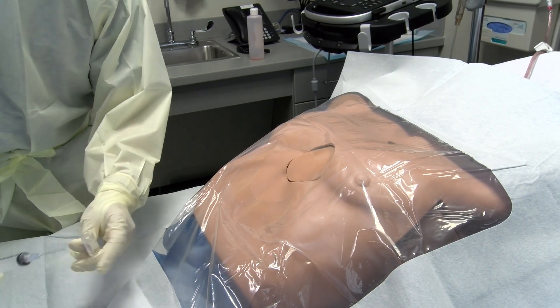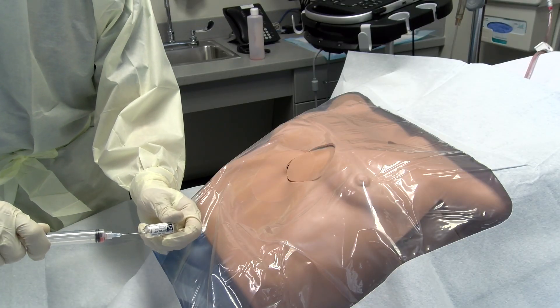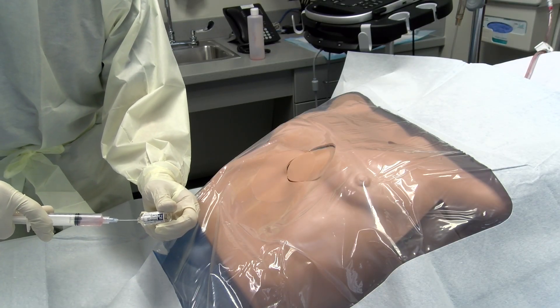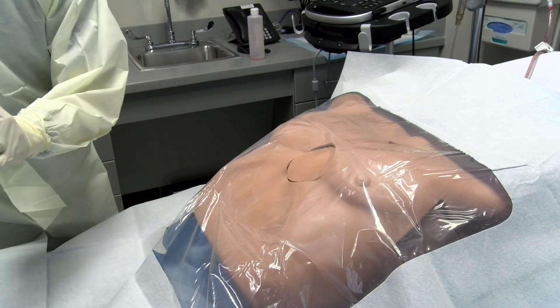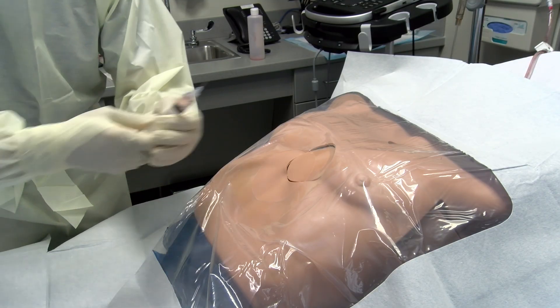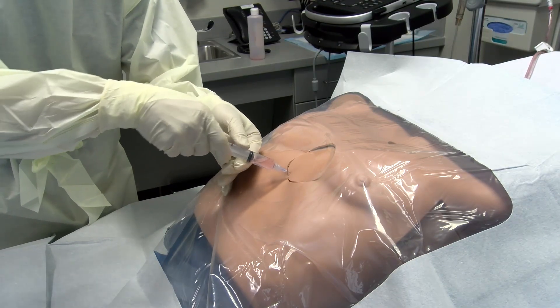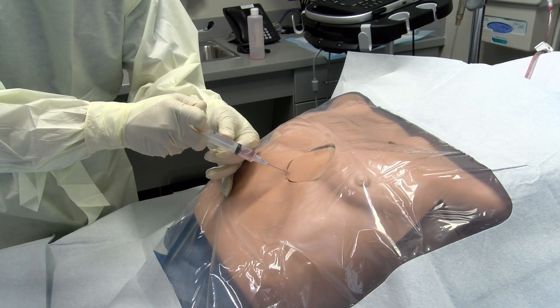Lidocaine should be drawn up and injected into the planned track of insertion for the pericardiocentesis needle. This track should begin one centimeter inferior to the subxiphoid space, slightly left of center, and directed at a 30-degree angle toward the left shoulder of the patient.